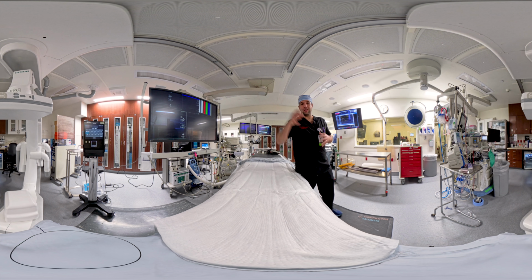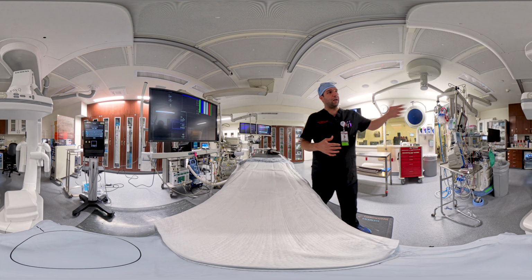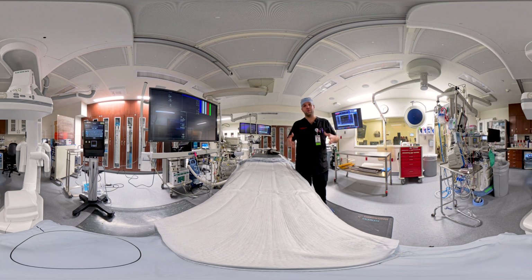Behind you to your left is the ultrasound machine, which I use to get access to the veins in your leg without having bleeding issues. Behind you to the right is the anesthesia machine, where an anesthesiologist will be taking care of you throughout the procedure and will maintain your breathing until you are awake from the procedure. And that's if you are under general anesthetic. If you're not under general anesthetic and we're using moderate sedation, then I'll be taking care of the sedation in addition to my nurses who will be making sure that you're comfortable.